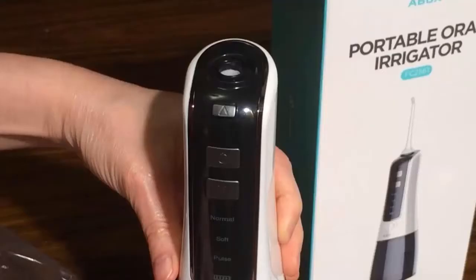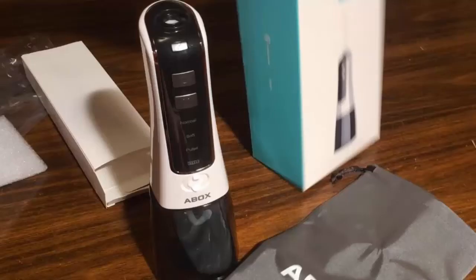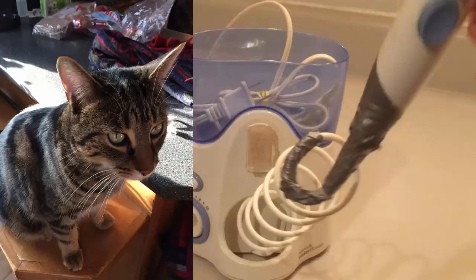Finally, the downside of this traveling model compared to the countertop is that the buttons are situated just where you need to hold the appliance, making it kind of awkward to handle and easy to turn it on and off accidentally.